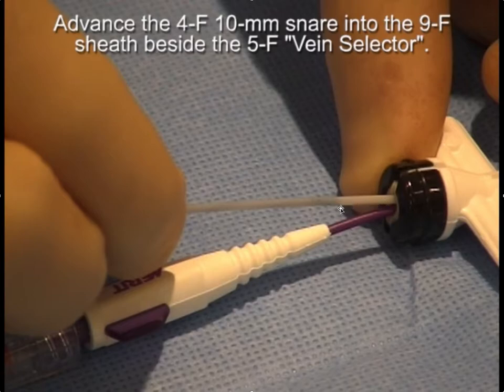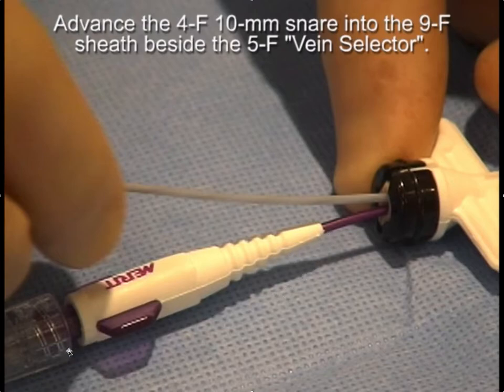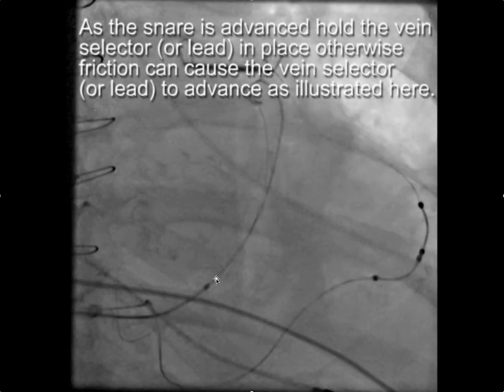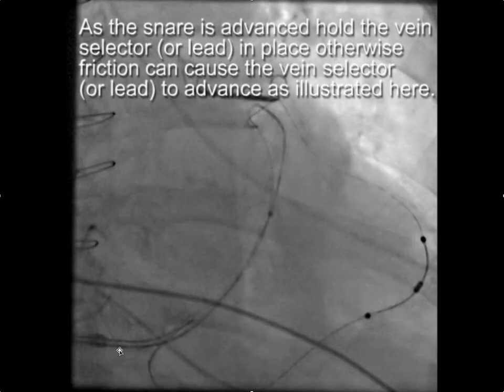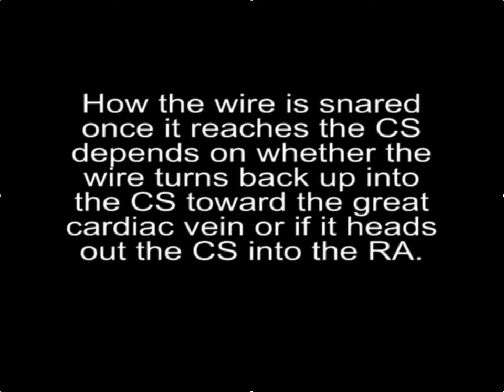As you advance the snare catheter beside the vein selector, be careful that the vein selector — or a pacing lead in that position — doesn't get pushed forward as the snare advances. As the snare is advanced, you need to hold the vein selector or lead in place; otherwise friction can cause it to advance. Here, the friction between the lead and the snare catheter pushed the pacing lead up into the coronary sinus, causing it to buckle and destabilize, so we had to reposition the sheath and reinsert the snare.